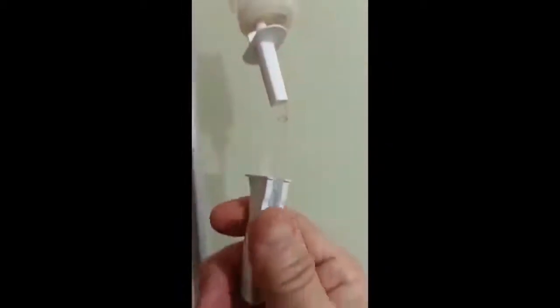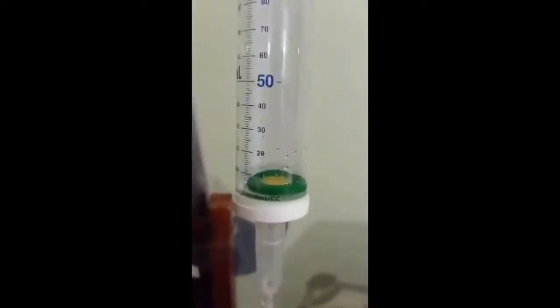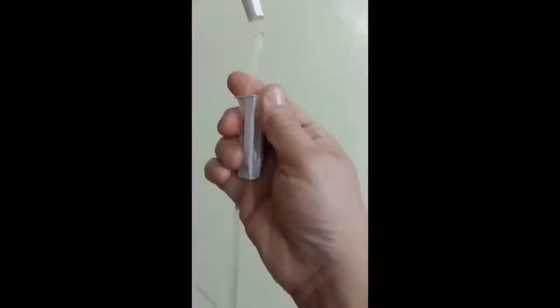Hang the solution container on the IV pole and then check for air in the tubing. If bubbles form, you can remove them by flicking the tubing, which gives gravity assist to deliver fluid into the drip chamber. Checking for air in the tubing reduces the risk of air embolism to the patient.